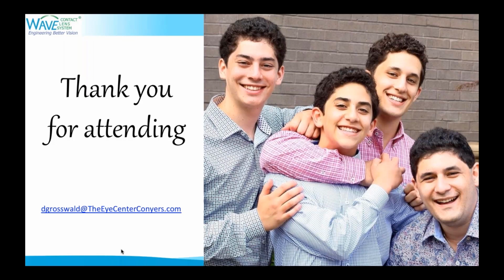Okay, thank you. And I will say, Charles, that it will not affect comfort. I cannot remember a time where I added prism and someone reflected that it changed the comfort of the contact lens. Okay, great. Yeah, we do get that question from time to time.